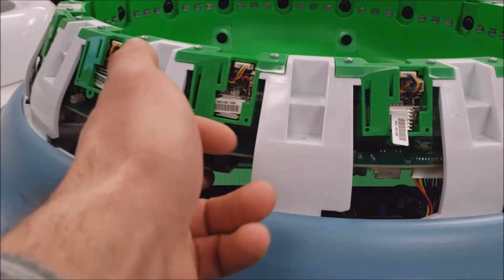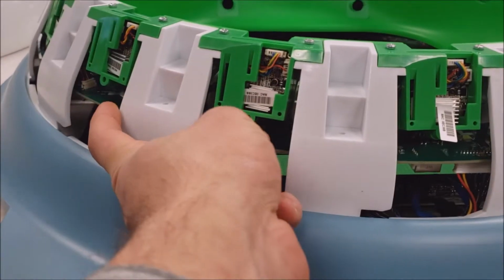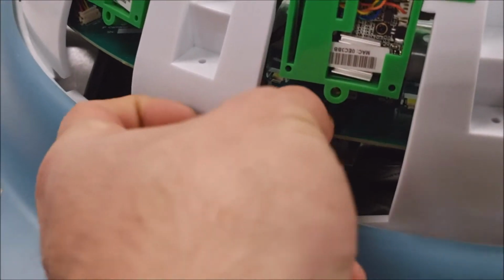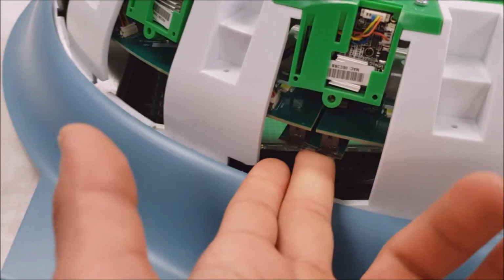To push these in properly, make sure you get your finger all the way in the back. Push in the back. You can hold here with your thumb on the top as well while you push, and then bring your finger up closer to the end. Push there again. Make sure it's secure in the back and in the front.